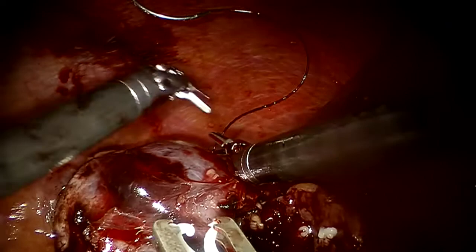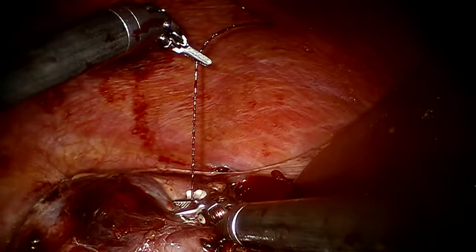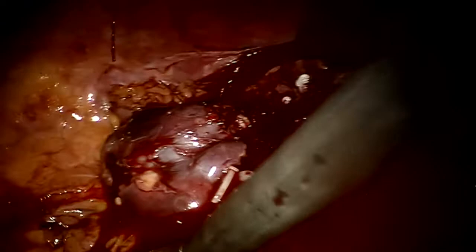Go ahead. Cut, please. Okay, I like it. I mean, there's pinkness right there. Good. And there's pinkness right there, so that's good. A little bit of posterior branches, obviously. Okay, go ahead, guys. Bolster stitches, 3 of them, 4 of them. I think it's looking good. Suction, suction, get the clot out.